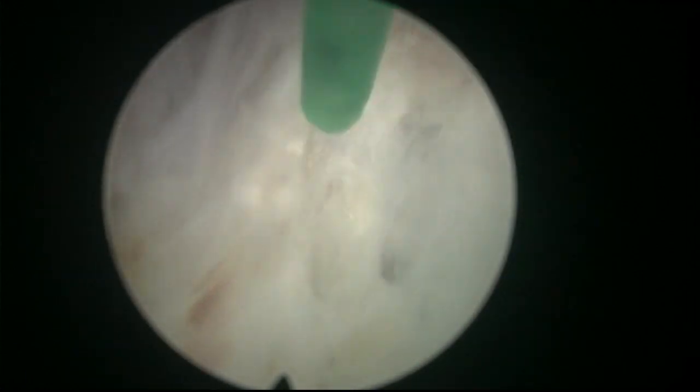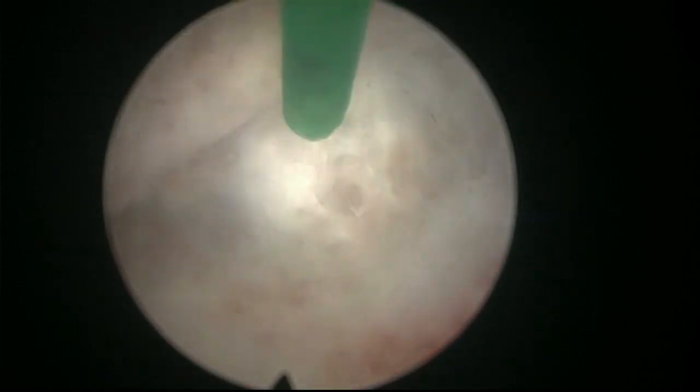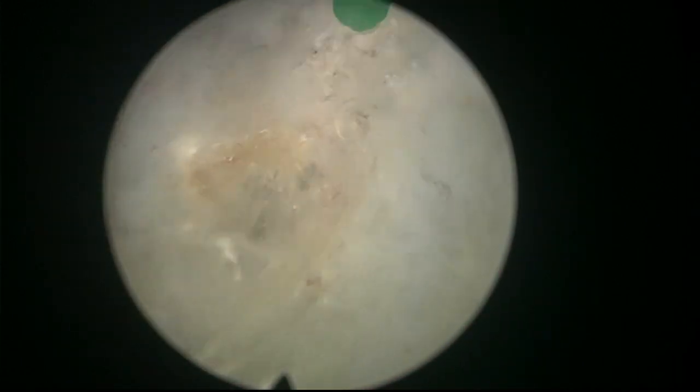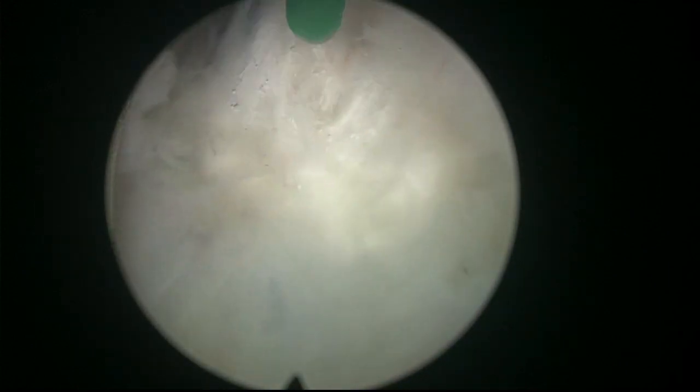And it's quite easy to figure out what to do, because basically what you want to do is to dissect the adenoma and push it into the bladder. So you want to go around it circumferentially. Not very difficult to understand and not very difficult to execute.